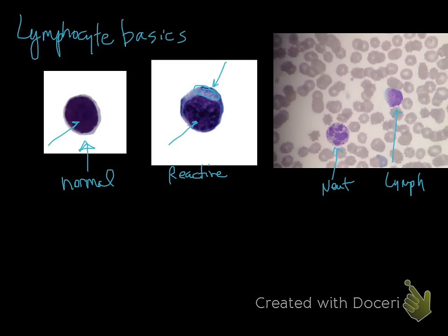And so this actually is a dog who has MPS, a lysosomal storage disease, but it's a nice illustration of a lymphocyte that is actually smaller than the neutrophil, which is normal. And it has that eccentric nucleus and clumped chromatin. What's abnormal is both of these cells have granules in the cytoplasm. Now, lymphocytes can have occasional granules in the cytoplasm, and they're just T cells or NK cells, but neutrophils shouldn't.